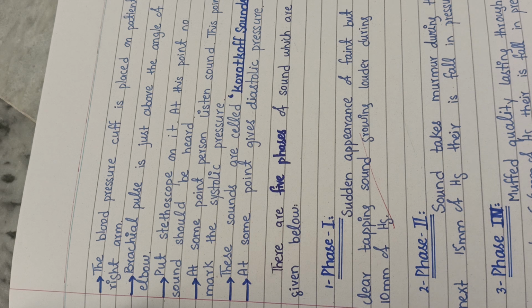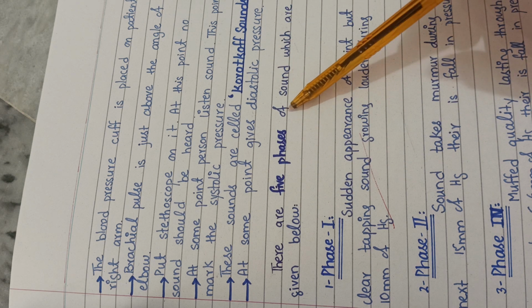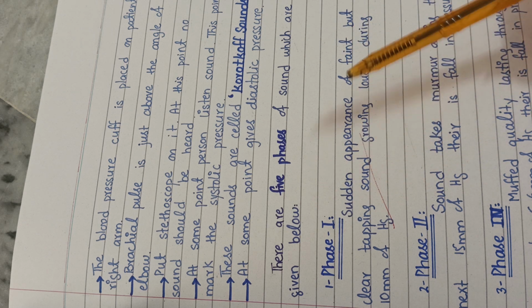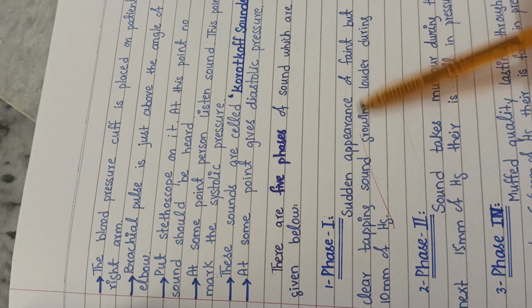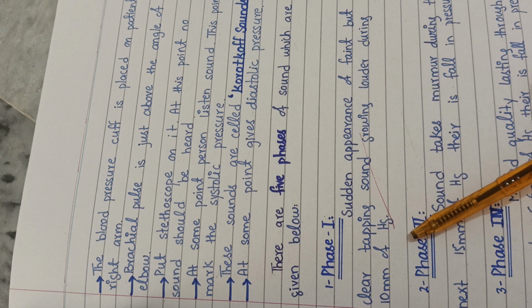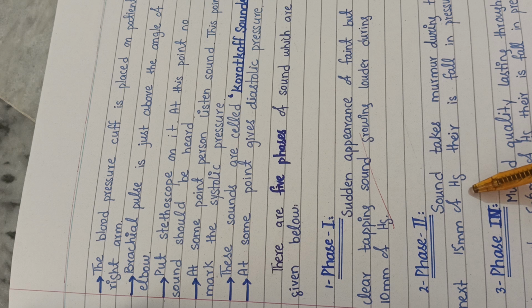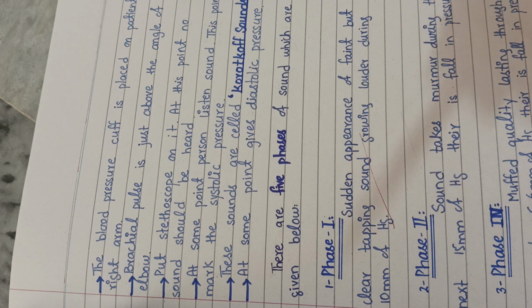These sounds are called Korotkoff sounds, named after the scientist. There are five phases of sounds which are produced. First is the sudden appearance of a faint sound, which increases with time, up to 10 mm of Hg. Then in the second phase, the sound becomes a murmur over the next 15 mm of Hg. So first suddenly you hear a faint sound, then it gradually increases, then in phase 2 it decreases over the next 15.